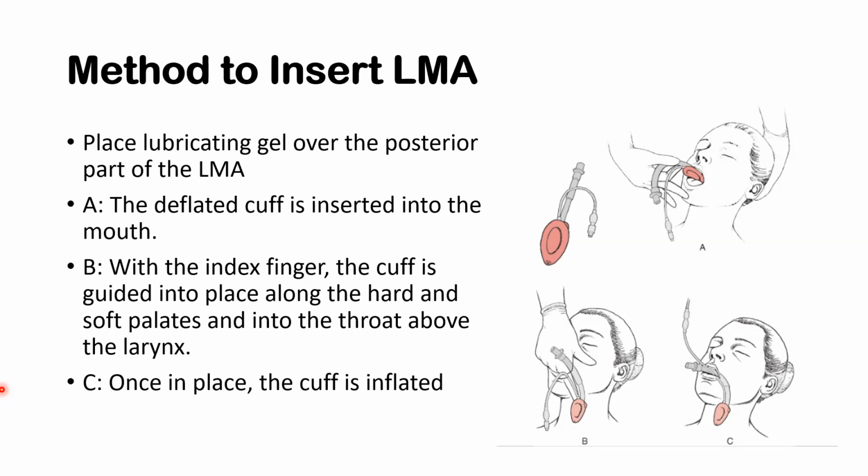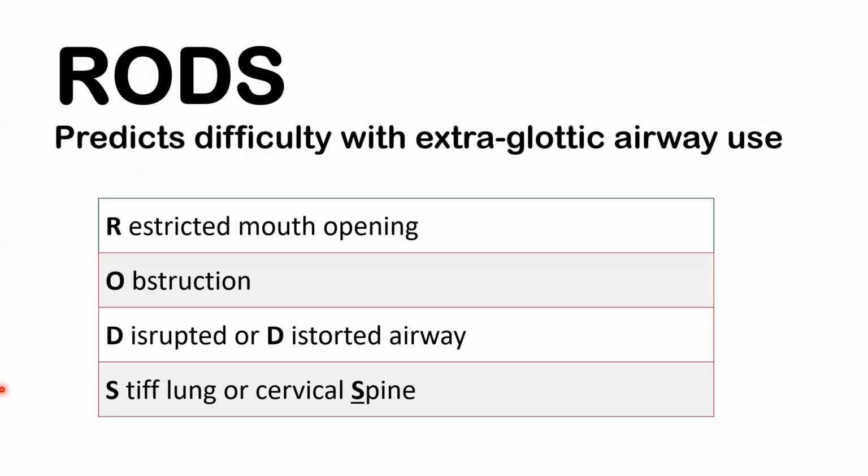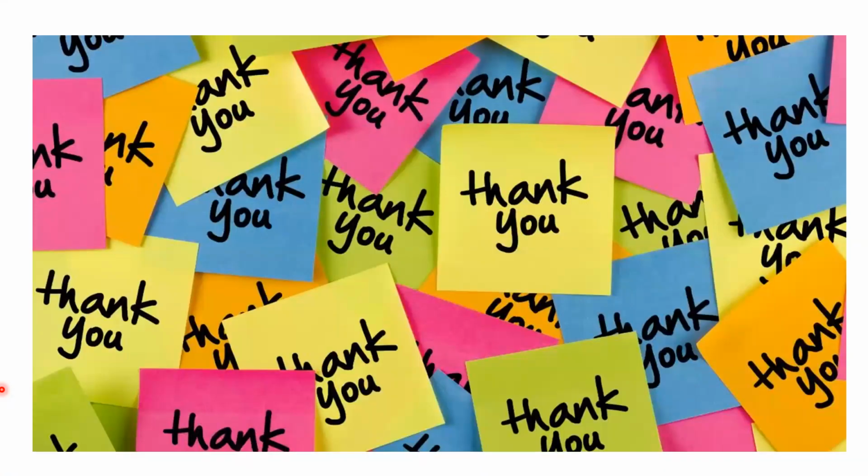Jangan terlebih keras, nanti dia dapat proses tertentu. Make sure can manipulate lah.